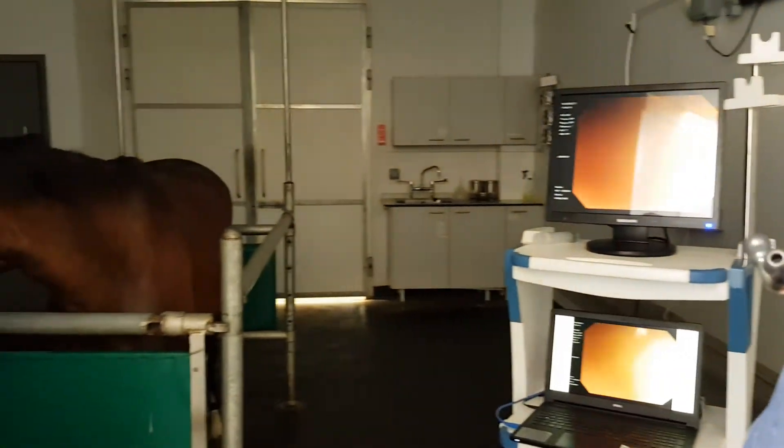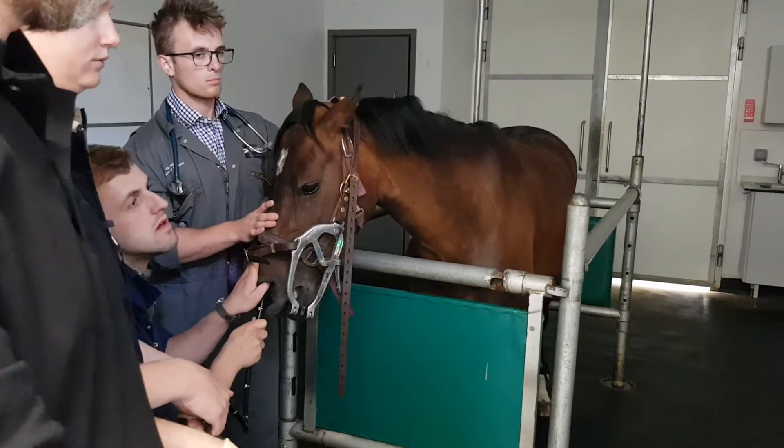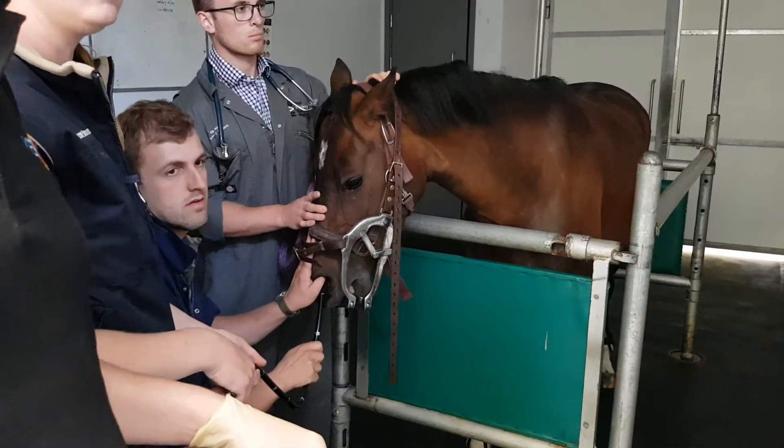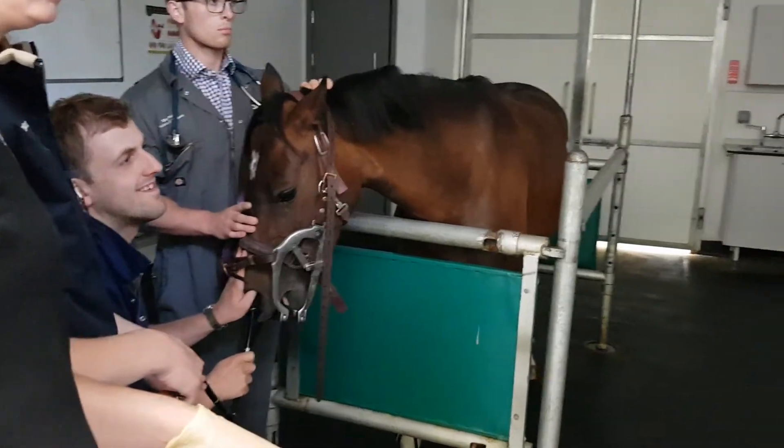Okay, put the note in. Okay, stop there. So, I'm just using the pump now by itself to... It's absolutely beautiful.